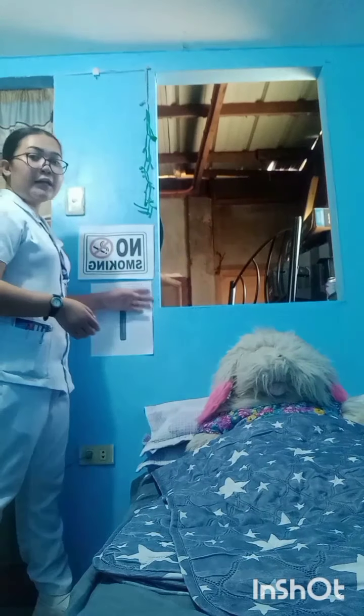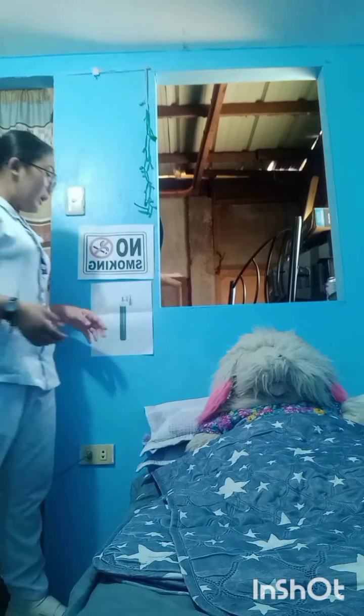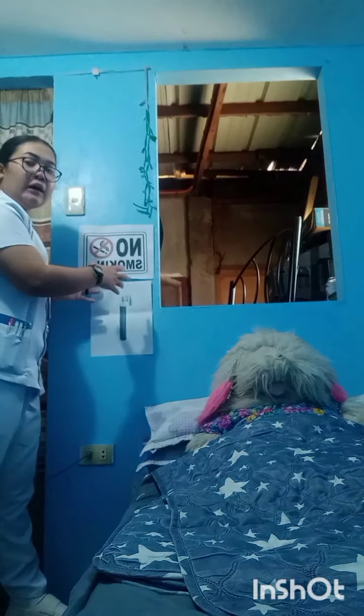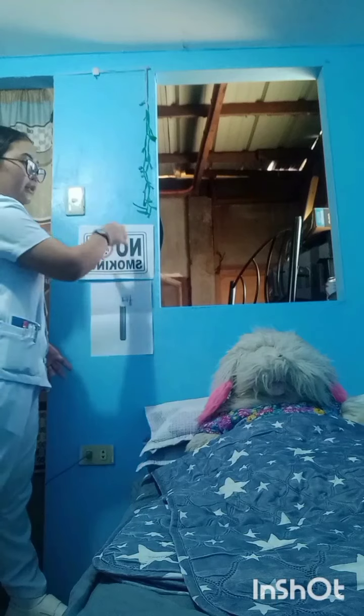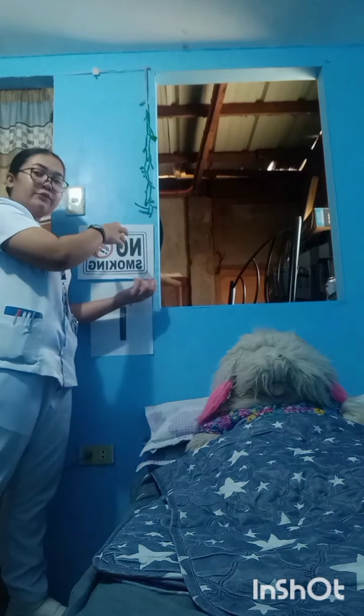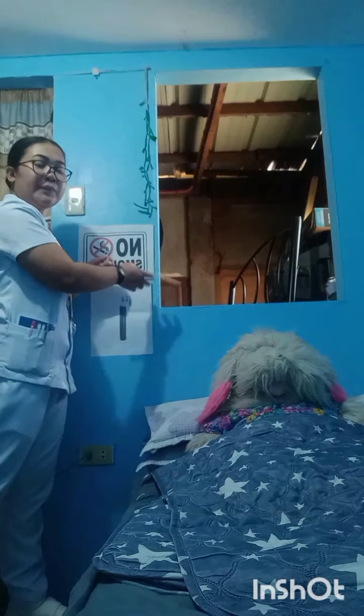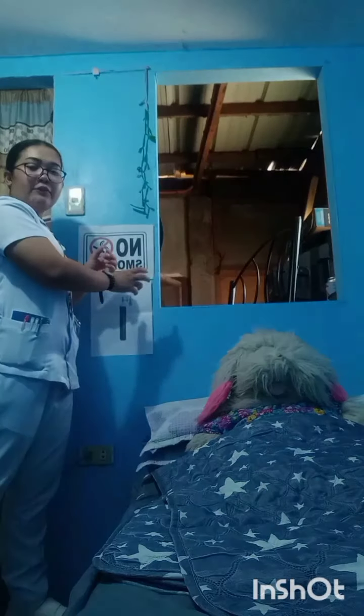Next is we're going to attach our humidifier bottle to the base of our flow meter dito. Kung makikita mo, kasi picture lang ito, so assuming malaki ito, tapos nandito yung oxygen tank, tapos nandito yung flow meter, sa baba mo siya i-attach sa base ng flow meter. Doon mo i-attach yung humidifier bottle.